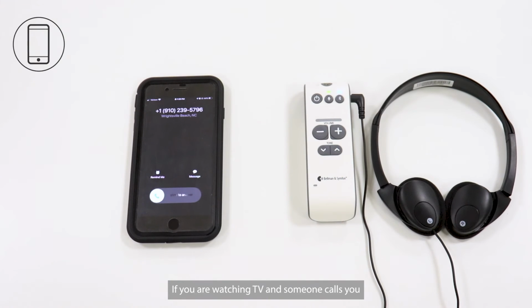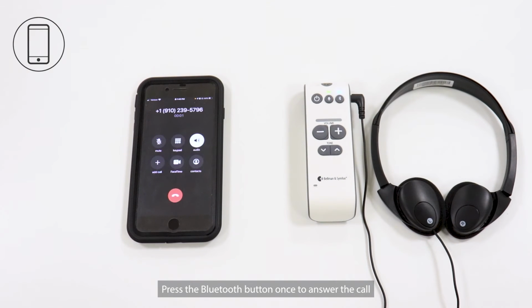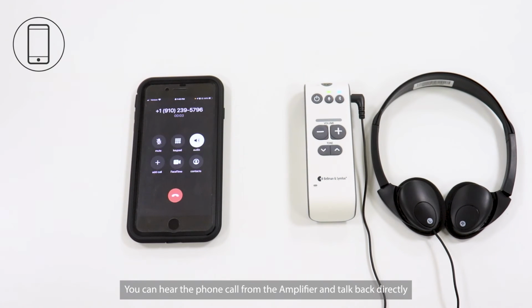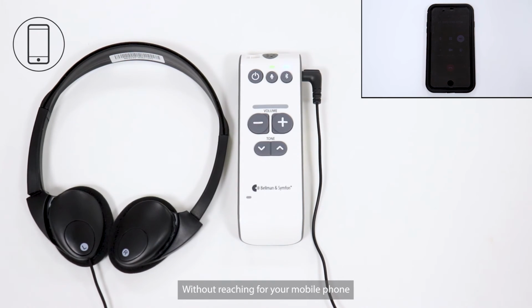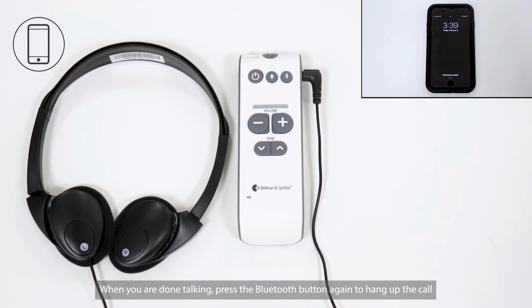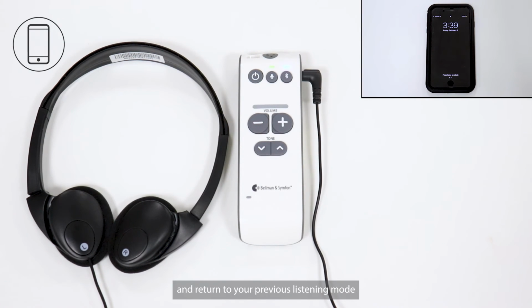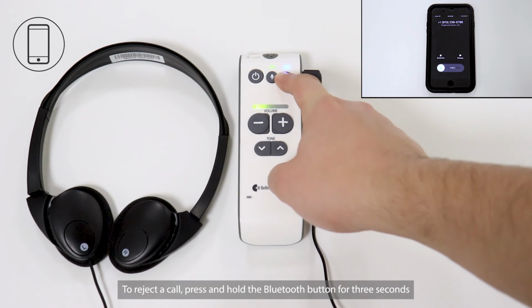If you are watching TV and someone calls you, you will hear a ringing sound from the amplifier. Press the Bluetooth button once to answer the call. You can hear the phone call from the amplifier and talk back directly without reaching for your mobile phone. When you are done talking, press the Bluetooth button again to hang up the call and return to your previous listening mode. To reject a call, press and hold the Bluetooth button for 3 seconds.